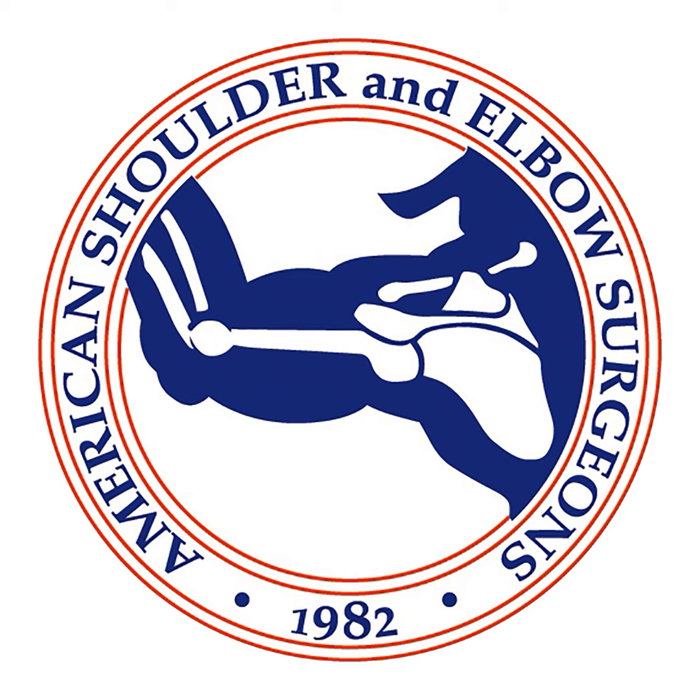So we've heard the good. Let's hear the bad. So, Dr. Wiater, what are the disadvantages? What are the problems we've encountered with stem components? Well, there are some disadvantages. It is more invasive than a stemless implant, so you have to remove more bone. It does require at least reaming, if not reaming and broaching, the proximal humerus and humeral shaft. In a revision situation, that can lead to diminished bone stock, which can complicate matters.